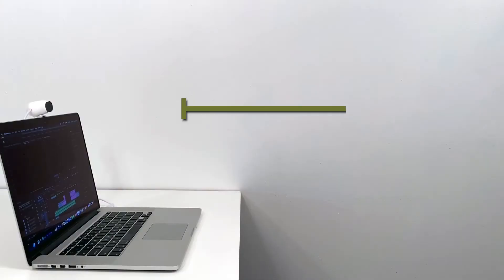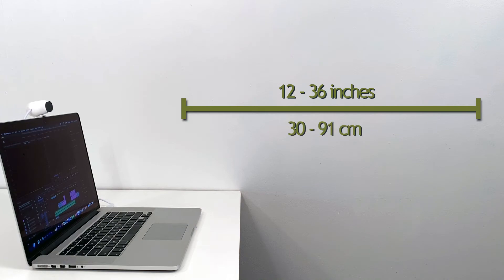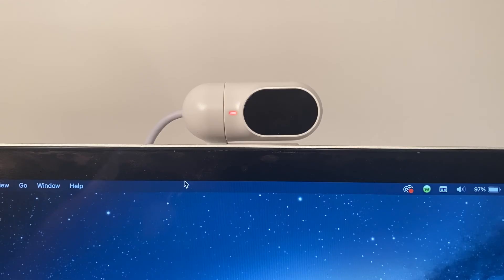Position the user 12 to 36 inches away from the Tracker Pro 2. The power status LED on the Tracker Pro 2 will turn green once it detects the reflective dot on the user.